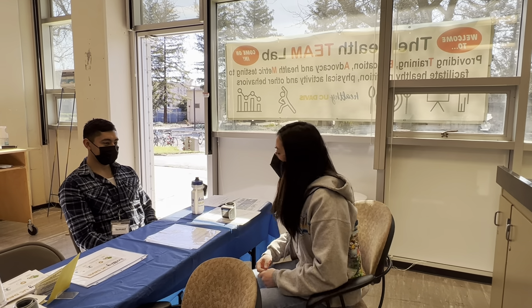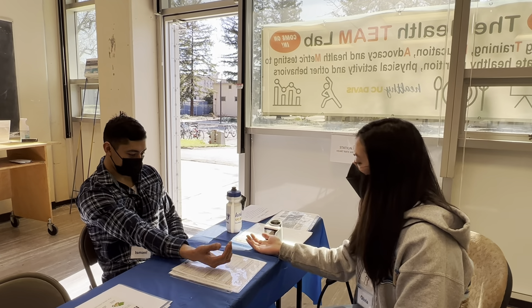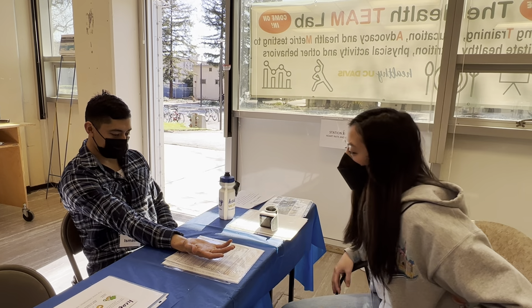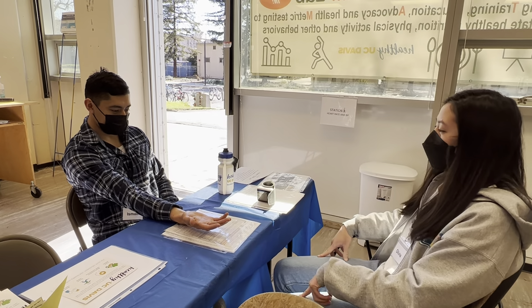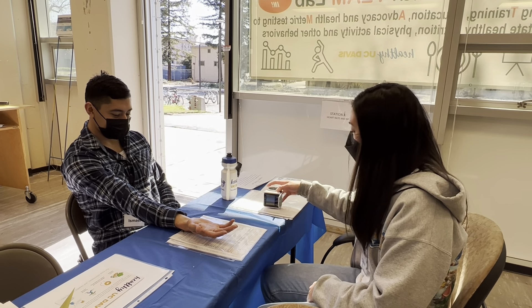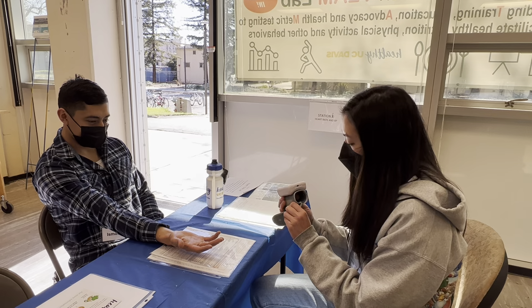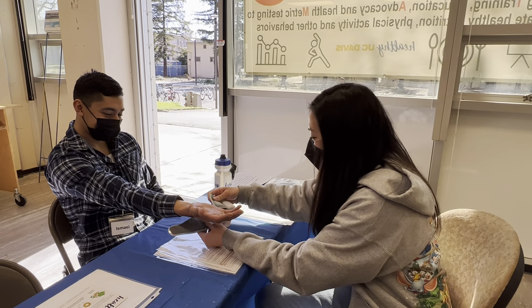We're going to have the participant have their arm on the table like so, with palm facing upwards. They're going to relax, feet on the floor, uncrossed legs, back against the chair, and then we're just going to put this cuff over their palm like so.